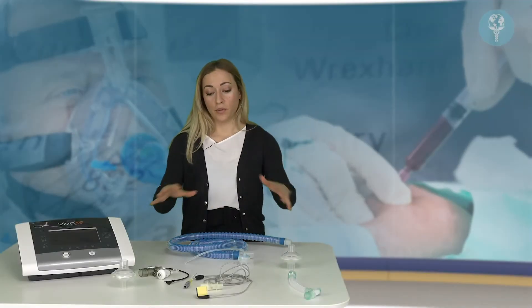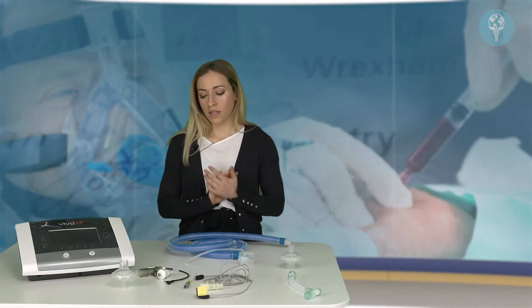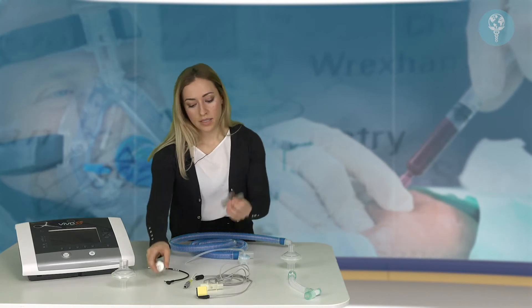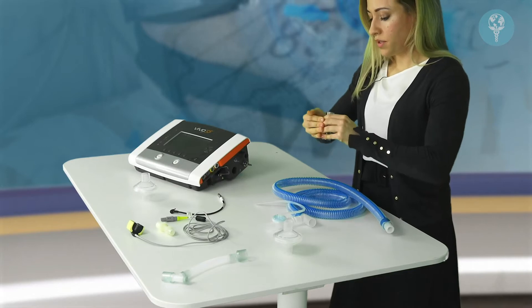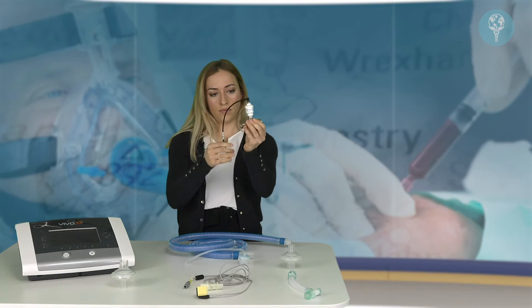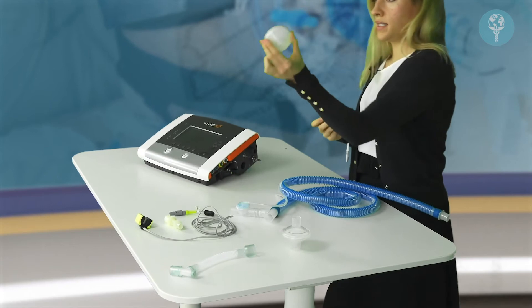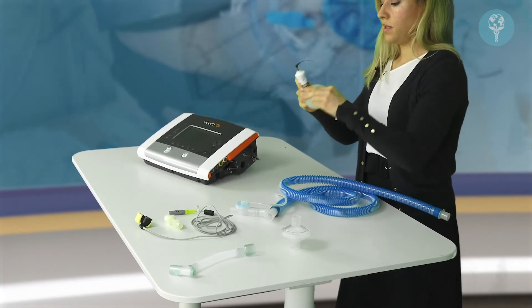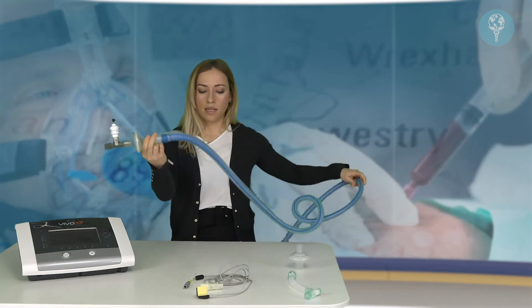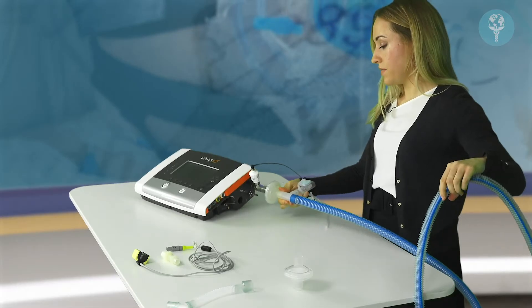Now we're going to go through how to assemble all these components together to form a circuit for invasive ventilation. To start, we assemble the FiO2 sensor — take the T-piece and the sensor, push those two together, and then connect the cable to the top of the device. Then we have our first antibacterial filter — these two connect together like that. That forms the one end of the circuit that would connect to the ventilator first.